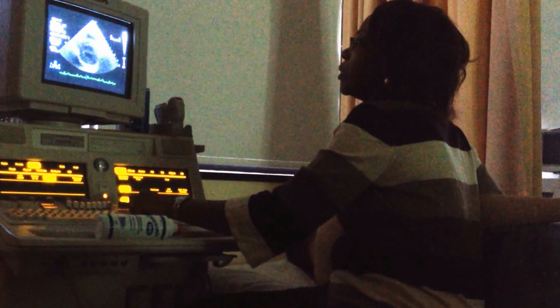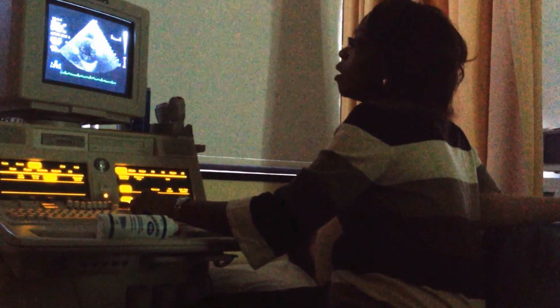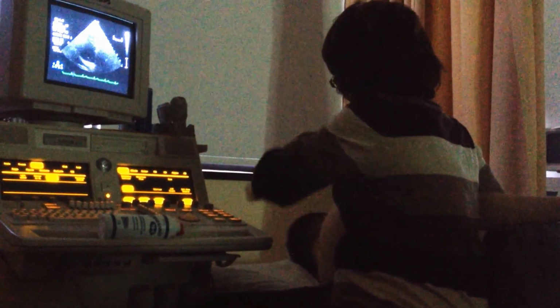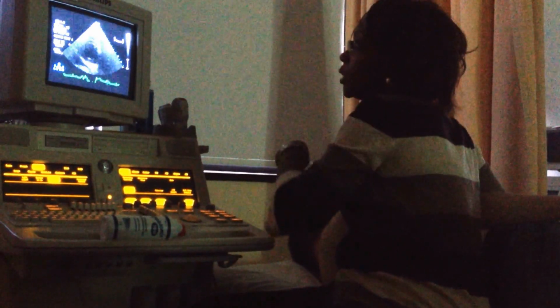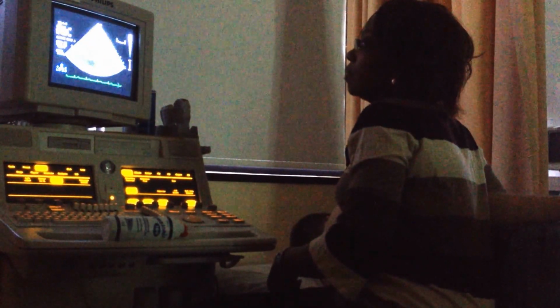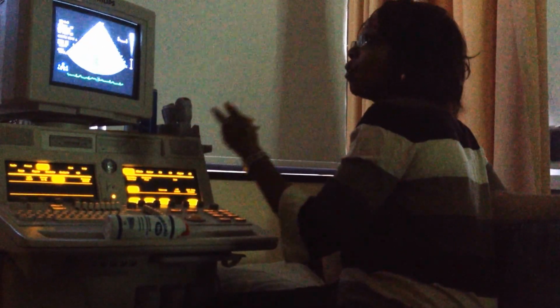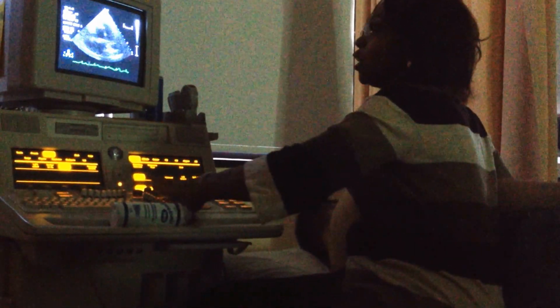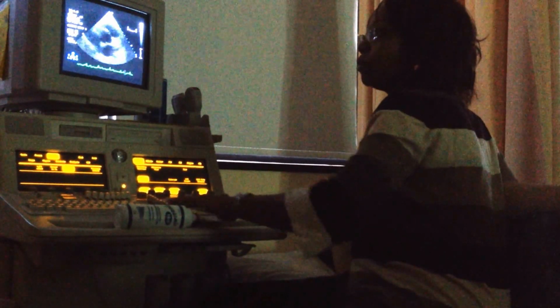There are my paps. And there's actually a fourth level all the way down to the apex, beyond the paps, if I keep angling the transducer tail up towards his nose. Okay? So that's the sweep. See, as I go up more close to the base, it's closer to the transducer, it gets so bright. This is when you gotta constantly change your gains and stuff.